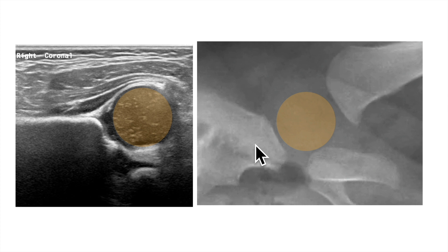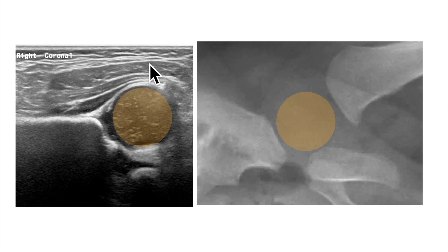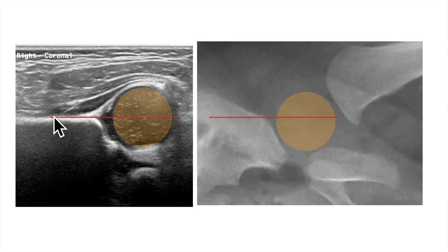Let's go ahead and draw some of our lines to see the anatomy. We already know that this is the iliac body, this is the acetabular tectum, and this is the unossified femoral head. The white stuff is the fibro-fatty pulvinar, and laterally it's going to be our subcutaneous tissues and the gluteus muscles. So we draw a line along that iliac body and extend it across the unossified femoral head. The second line we draw is along the acetabular tectum, which forms an angle — and this angle right here is what we report as the alpha angle.